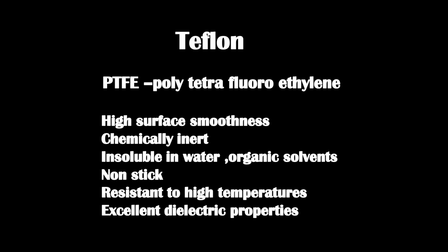It has some amazing properties which go unnoticed. It has very low coefficient of friction, so it has very good surface smoothness. It is chemically inert and it is insoluble in water and organic solvents. It is non-sticky and it is very resistant to high temperatures as well as solutions, and it has excellent dielectric properties. Teflon can be used in many ways.